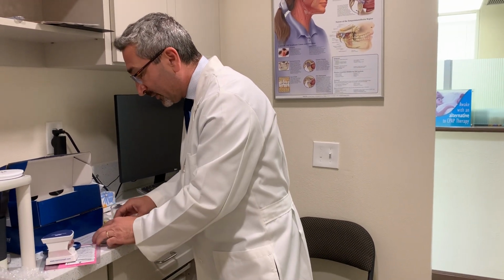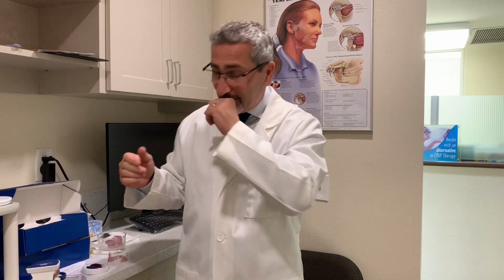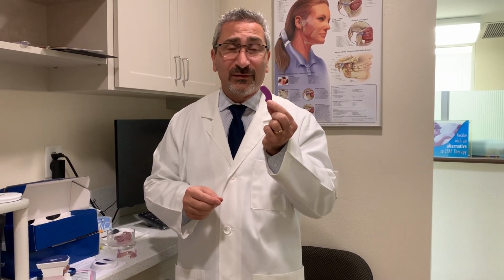In the mornings, when you wake up, take out the mouthpiece, give your jaw a break for about 20 to 30 minutes, brush your teeth, do whatever you're gonna do. When you come back to see me, I will make you a morning repositioner called the AM aligner, which I can't do at this time because we're on lockdown, but I have sent you a little rubber piece.